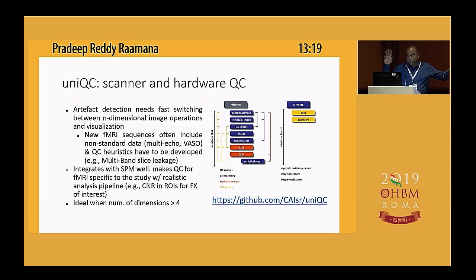Remember the overview picture I gave you: QC is not just in the image that is produced, but there is a bigger scope to it. So you want to think about QC in the acquisition processes, and in the images when combining across multiple sites.